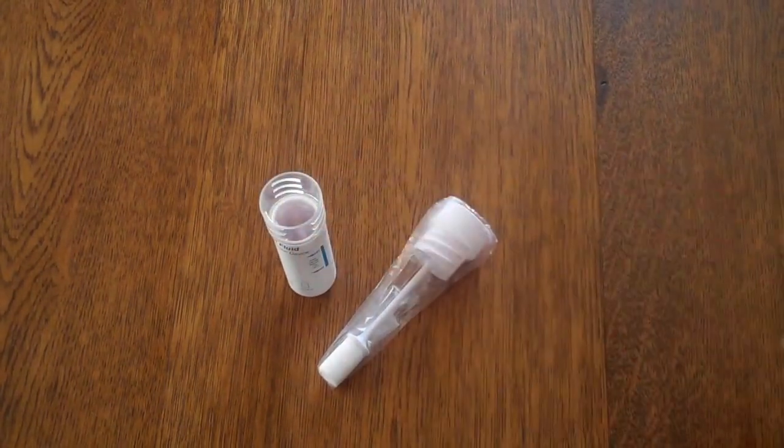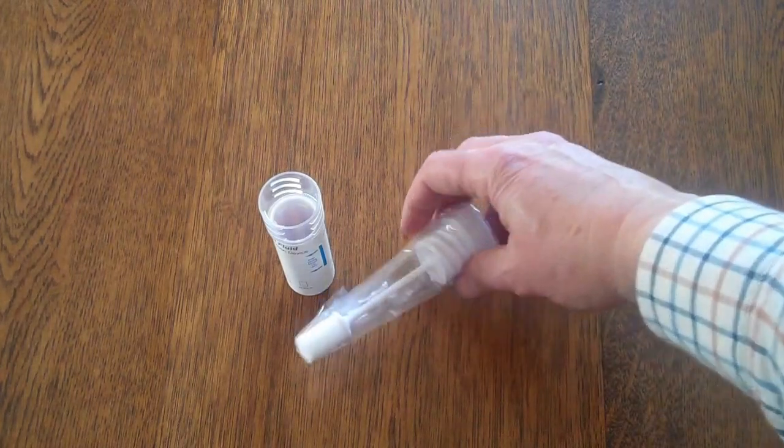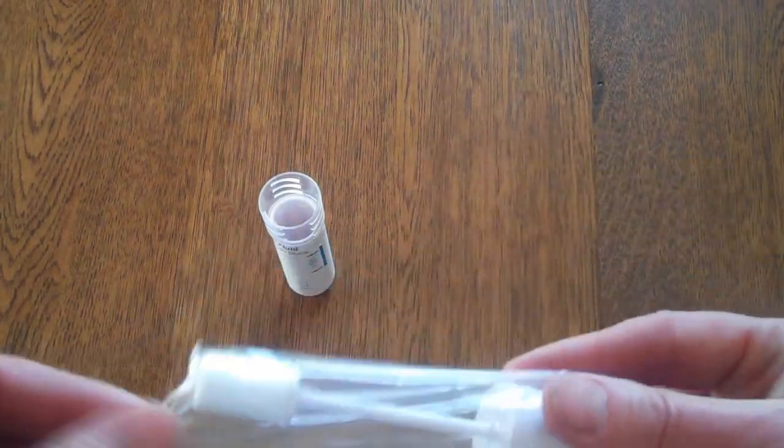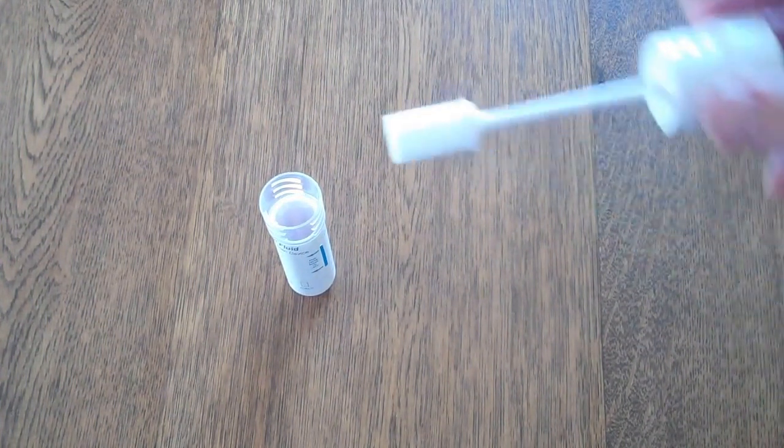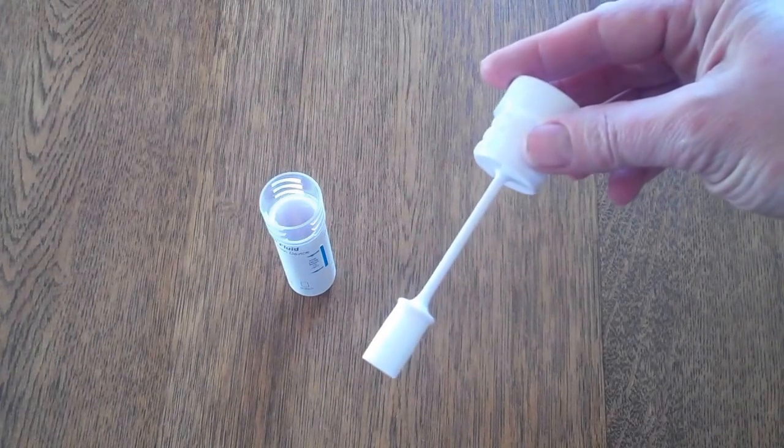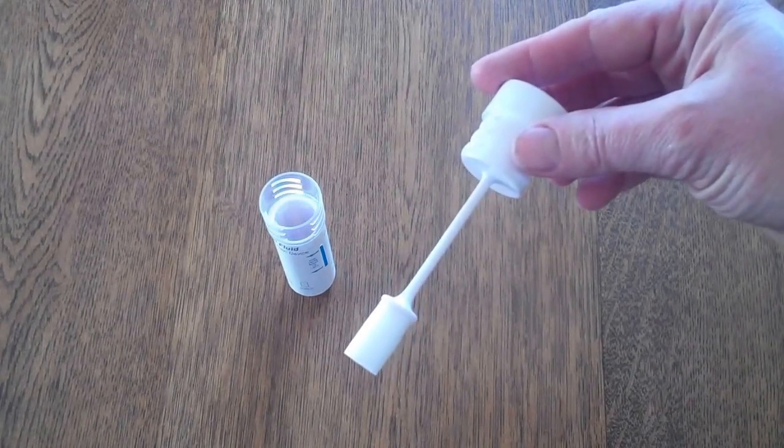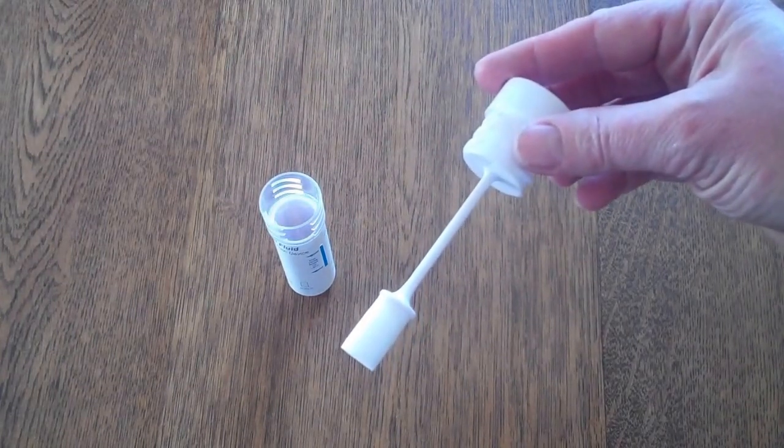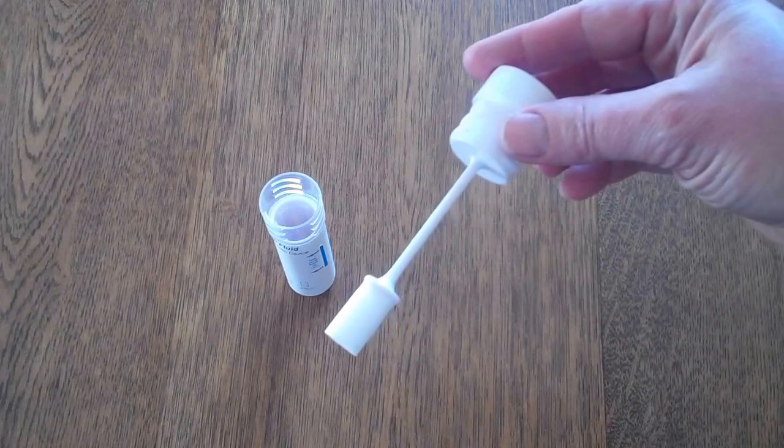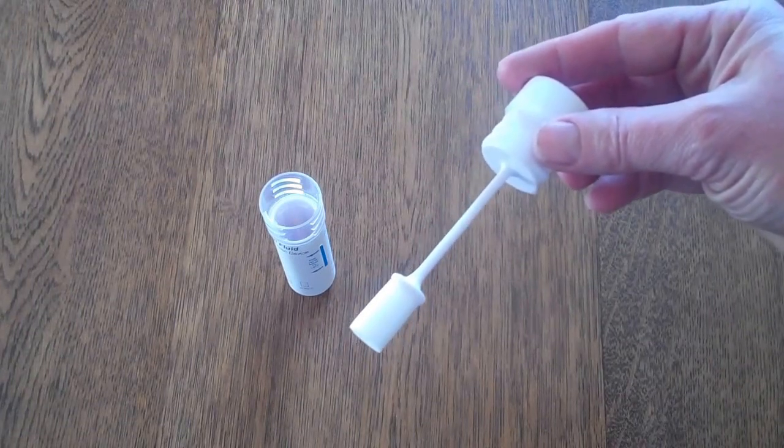So to perform this test, very easy to do, the swab is removed from its plastic cover and given to the person to whom you are requiring the test sample from. The swab is completely inert, there's no chemical constituent to it, it's tasteless and it's quite firm when it's initially opened.